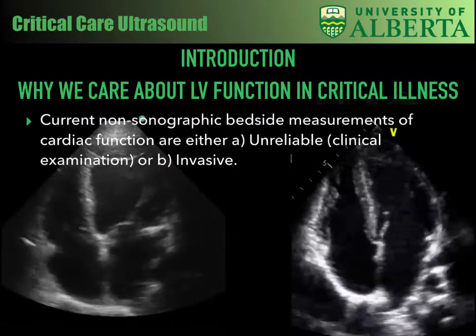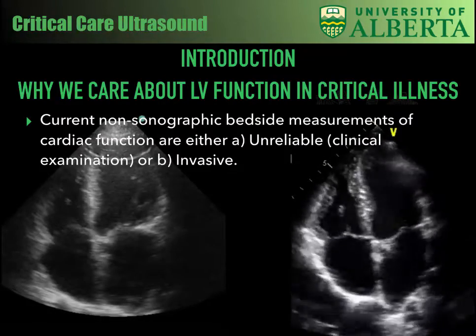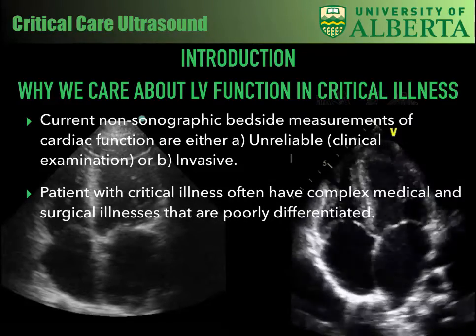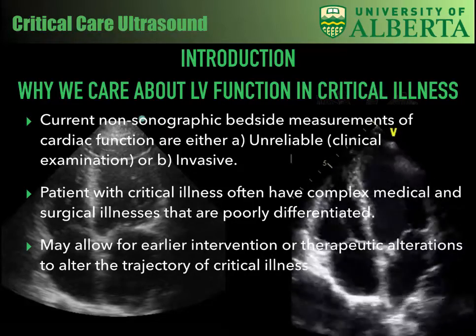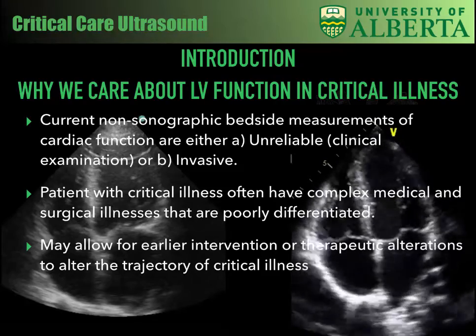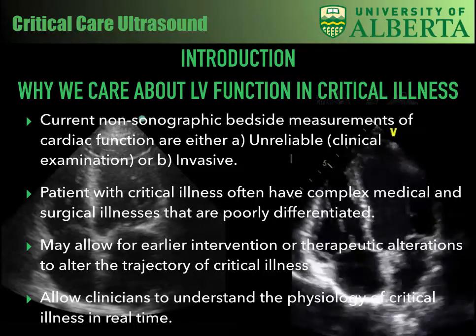Well, I think for most people it's obvious, but current non-sonographic bedside measurements of cardiac function are either unreliable, such as clinical examination, or they're invasive. Patients with critical illness often have complex medical and surgical illnesses that are poorly differentiated. And hopefully, discovering impairments in LV function may allow for an earlier intervention or therapeutic alterations to alter the trajectory of critical illness. And this can allow clinicians to understand the physiology of critical illness in real time.